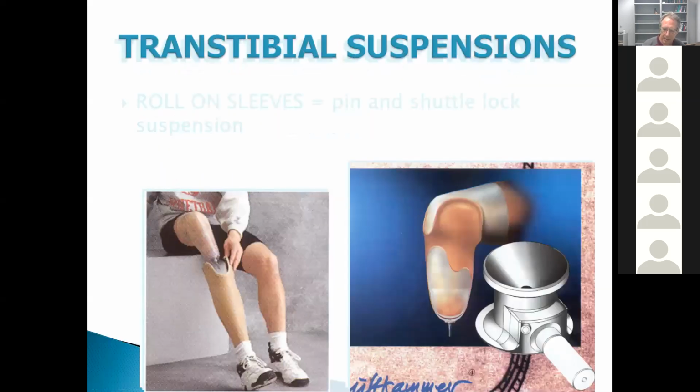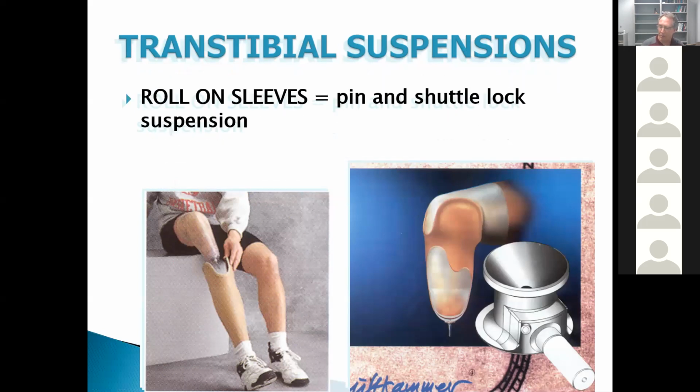Okay, now this is the most common. I'll show you the slide and then I'll stop the share so I can actually demonstrate this, the pin and shuttle lock. So what happens here?